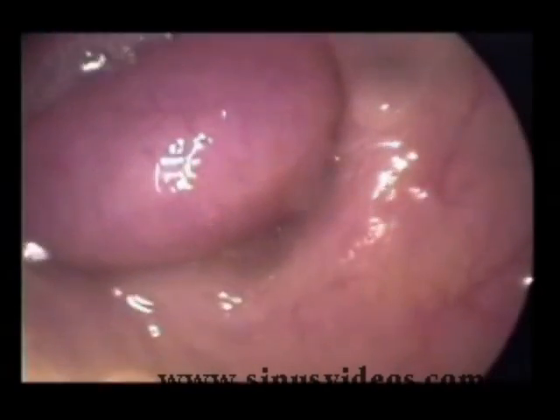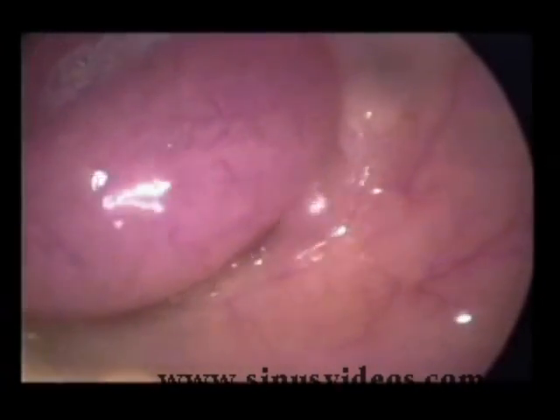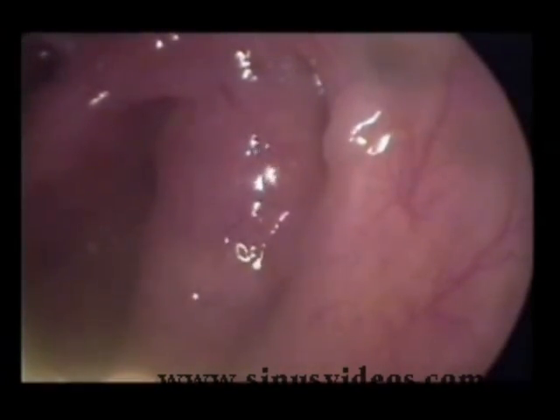Here in slow motion, we see the adenoid which normally does not cover the eustachian tube orifice. Instead, it contacts the posterior cushion of the eustachian tube and forces it anteriorly during swallow to block the tube — paradoxically, just when it should be opening.